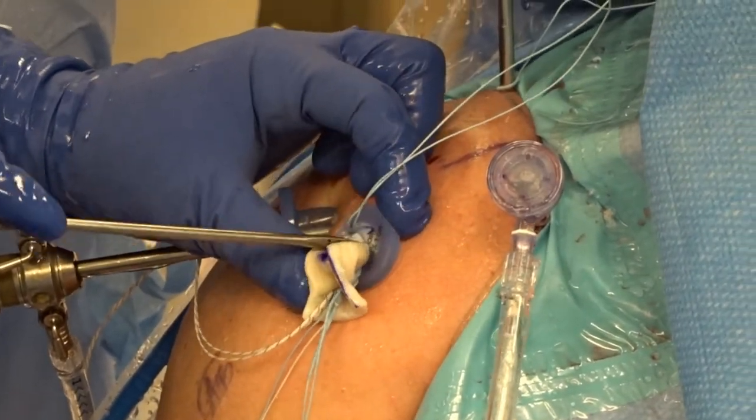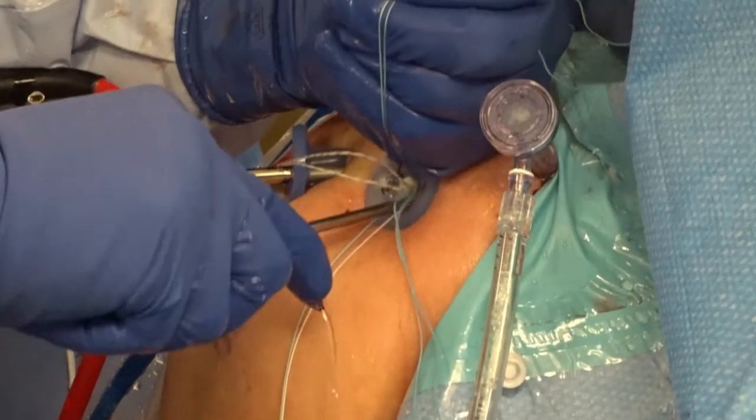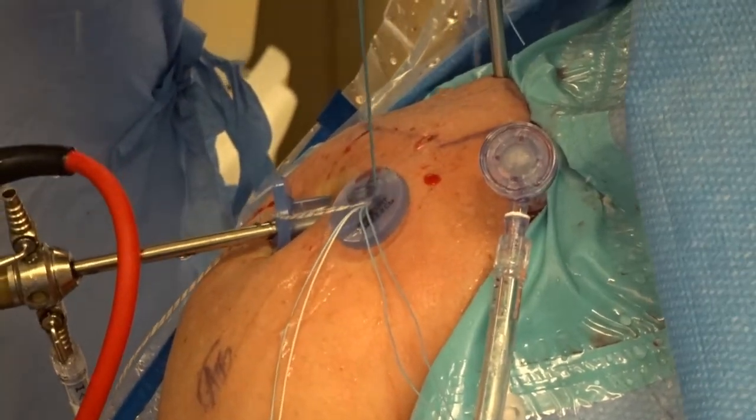The Arthroflex graft is then introduced through the passport and into the subacromial space using a Kingfisher grasper. By pulling the limbs from each double pulley, the graft will set itself into position medially and laterally.